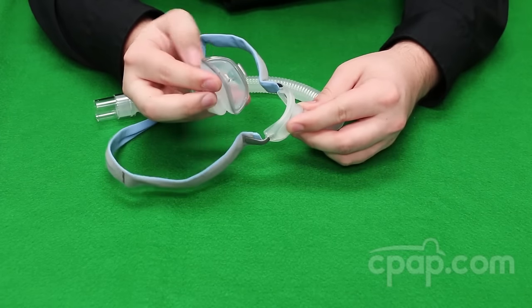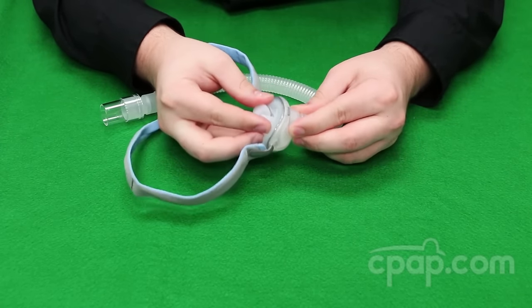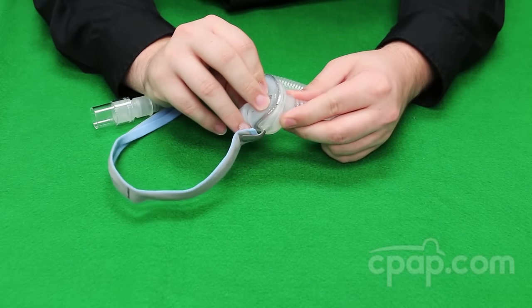To add the pillow back onto the mask, line up the larger bottom clip on the bottom and the smaller upper clip on the top and push to lock into place. Because of the different size clips, the pillow cannot be inserted upside down. It will not lock into place.